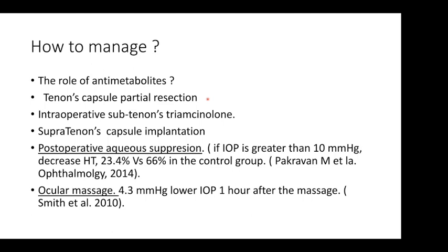If you encounter a lot of tenon, the tenon is the source of this capsule. So some suggested resection of the tenon, intraoperative triamcinolone subtenon, or supratenon capsule implantation. Some reports place the implant on top of the tenon. This is technically very difficult, but also can lead to erosion of the conjunctiva. But what's really common in practice is to use aqueous suppressants.